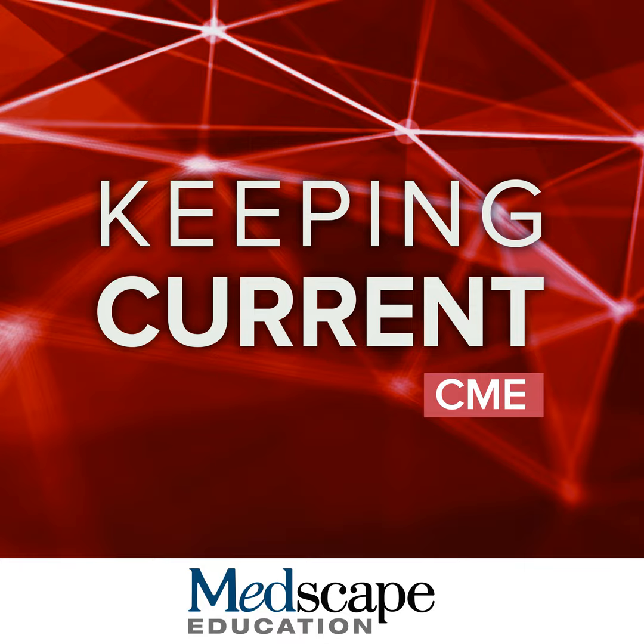I do know that some research studies go as low as 20 or 25 for positivity, but we're using 30 in our clinical population. The next question is, how important is a Z-score value in Alzheimer's disease? The Z-scores are common with a lot of the software for processing the PET scans, and it can be very, very helpful to the neurologist in order to identify where abnormalities are and how they're different from controls.